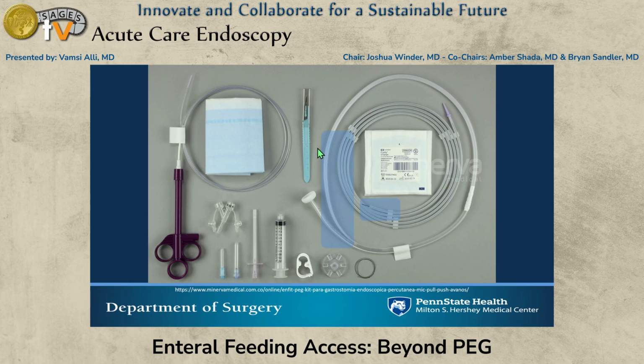You can see this entire region here is one long dilator. There's a straight guide wire that's introduced through your percutaneous gastric access, retrieved through the mouth, and this entire dilator is sort of like a swallow the sword, dilated all the way down through the esophagus, and you still are holding on to this portion here by the time the dilator emerges through the abdominal wall.